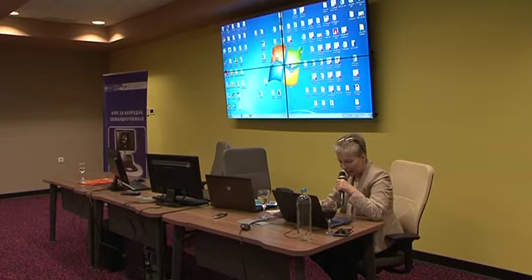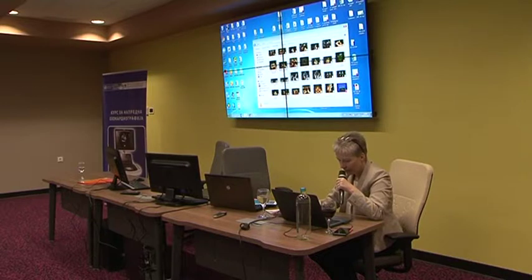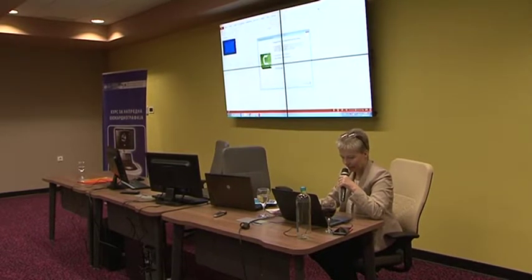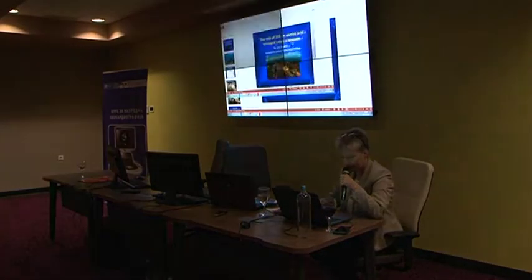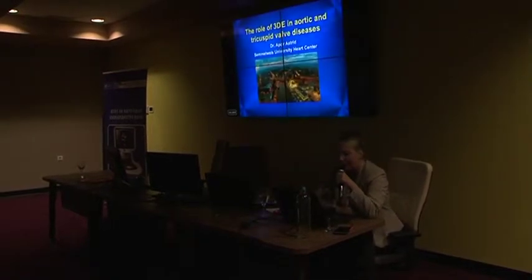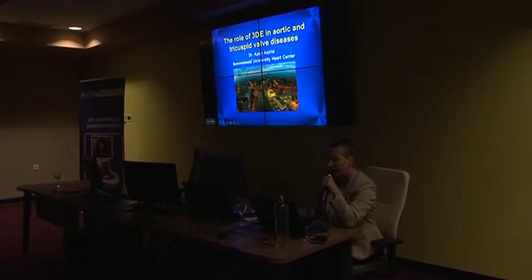So let's continue with another lecture. And it will be on the role of the 3D echo in aortic and tricuspid valve disease.